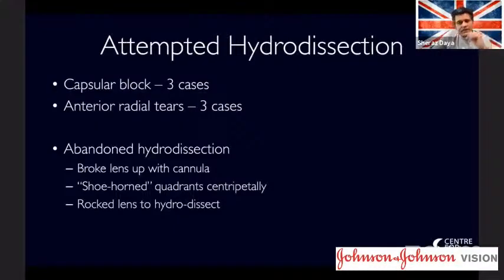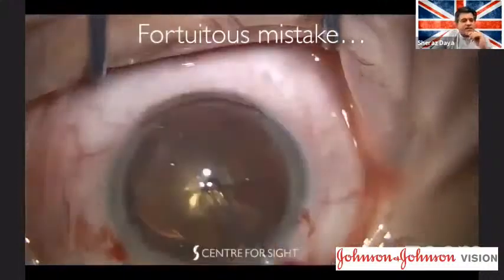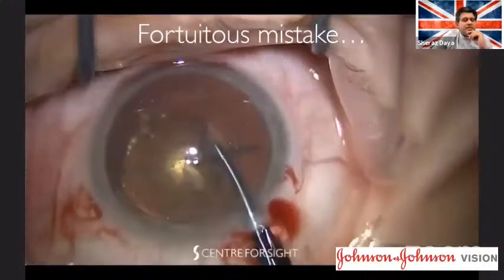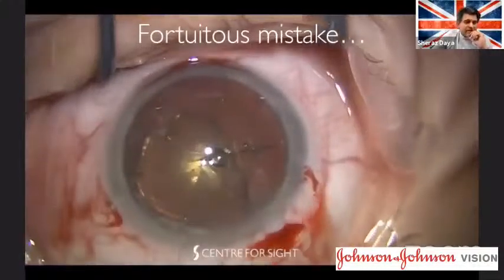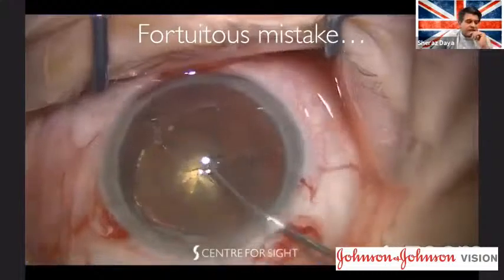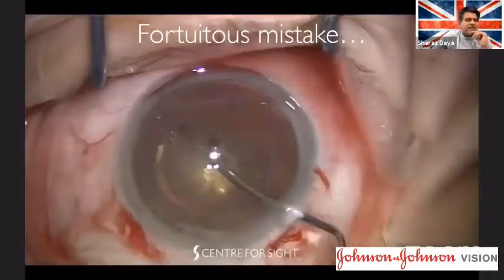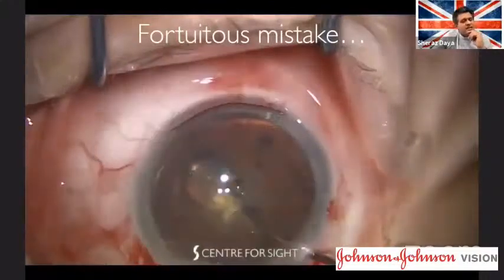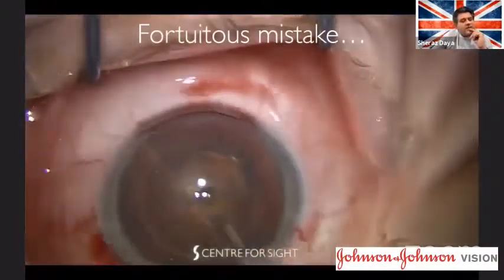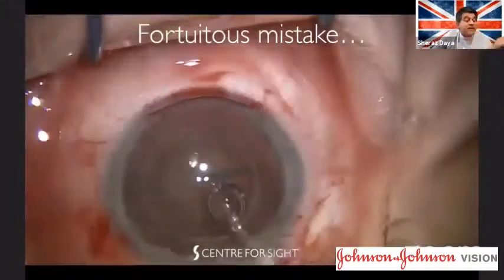One day when I was doing this, I decided to use a cannula. This is a cannula we use for hydrodissection. I'm just taking that capsule out there. And you'll see me injecting fluid by mistake. So here I'm going into the fragmentation, and by mistake I inject the fluid, and that hydrodissected the lens. I said, wow, is that my mistake? Well, maybe I should try and do that by design. So I did, and it seemed to work very well. You can see that lens is spinning beautifully inside the capsular bag.